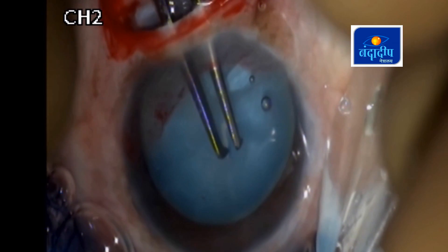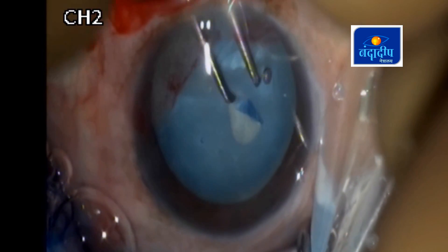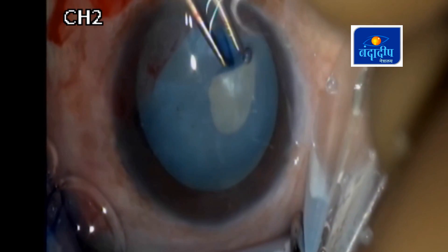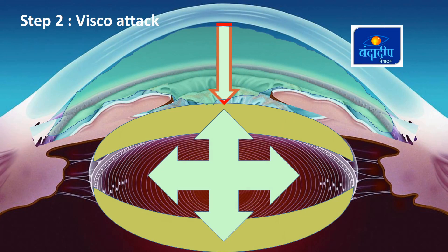Step 2 demonstration: If we don't do closed chamber maneuvers — as in this case where I am trying to achieve CCC with an open incision — there is a higher risk of radial extension of the tear because there is no counter pressure over the intralenticular pressure.